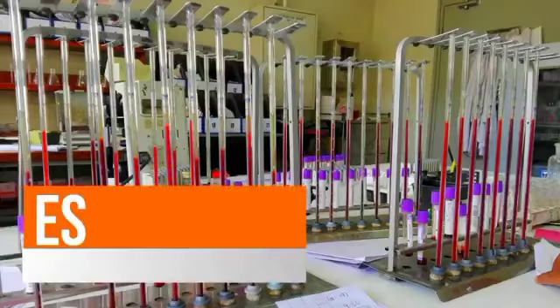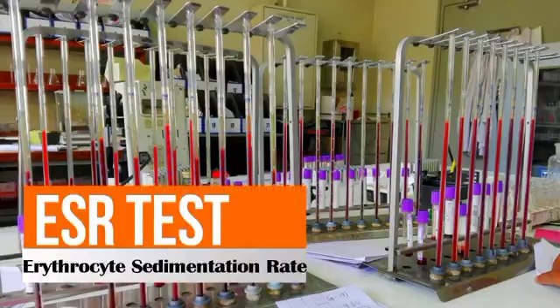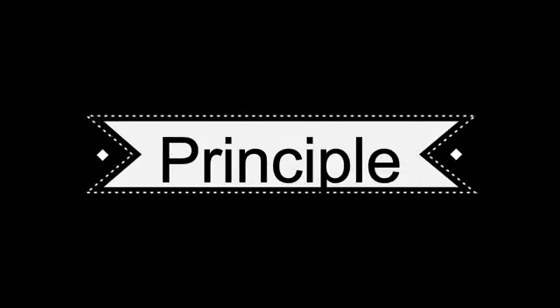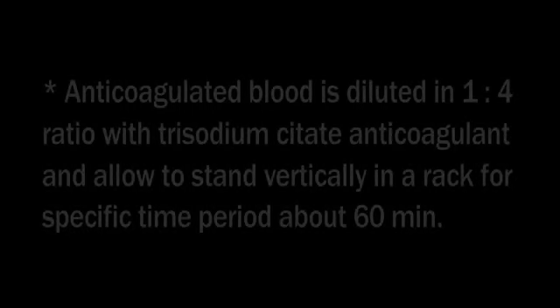Okay, today we are going to do the practical on ESR, that means erythrocyte sedimentation rate. Before we do the test, let's see what is the principle behind this ESR test.